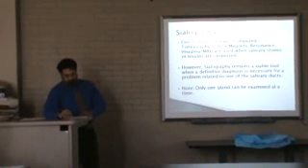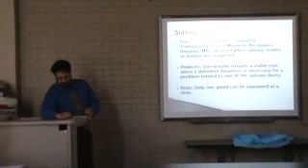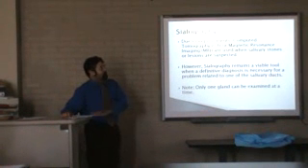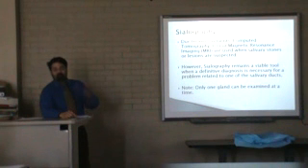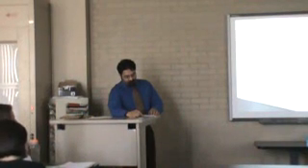Okay. So recently, because of advancements in technology, as in CT and MRI, they're usually used when salivary stones or lesions are suspected. Because obviously when your ducts are blocked up with stones or there's lesions there, they won't be able to inject contrast media, they can't take a radiograph of it. So it still remains a viable tool when diagnosis is needed for other things like large stones or lesions are suspected.